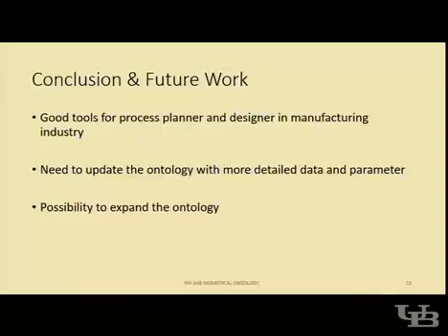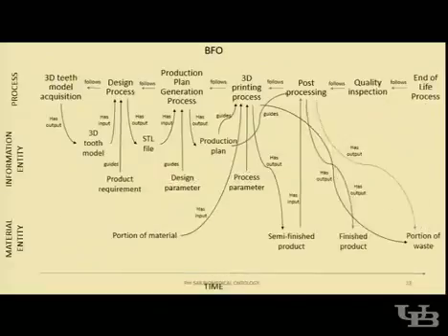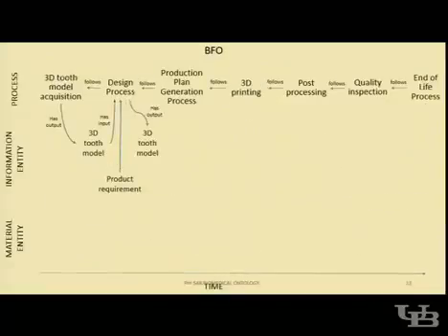One quick thing, I think you have a typo on slide 11. I think you have a 3D tooth model where you should have STL file, right? Is that right? Oh yeah. Just small thing. But what's the difference between guides and used in?